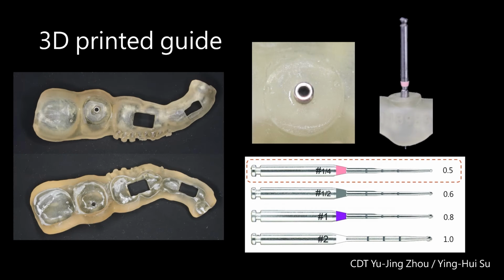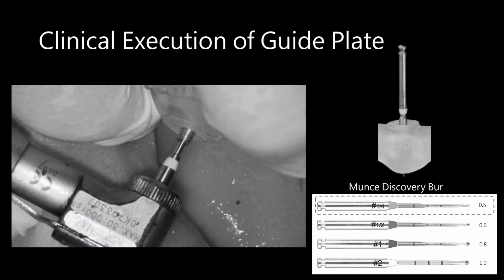So I printed it out, and I manufactured a metal sleeve here and used the burr, and the shank will fit into this hole, and I process it, I drill in it. But everyone seeing that will ask me, did you drill directly into the space?